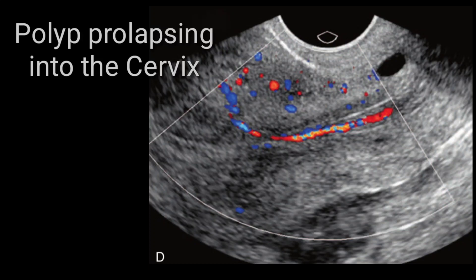On this transvaginal scan again, polyps can be seen coming all the way down from the endometrial canal and protruding into the cervical canal. If you see such a case for the first time it will be difficult, but gradually, as you review these images, you will be able to recognize prolapsing polyps in the future. These images play a vital role, so keep watching and get your eyes familiarized with how prolapsing polyps look on ultrasound imaging.